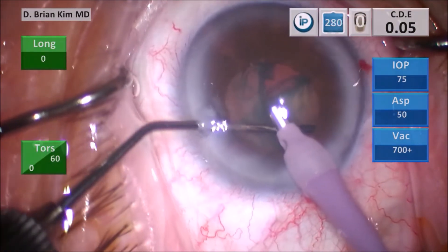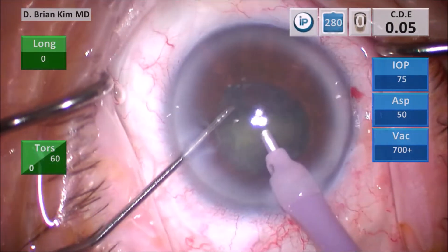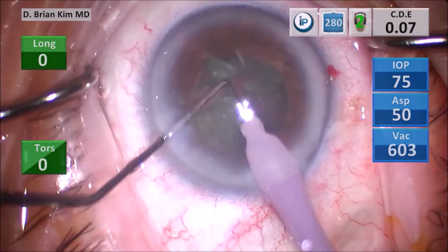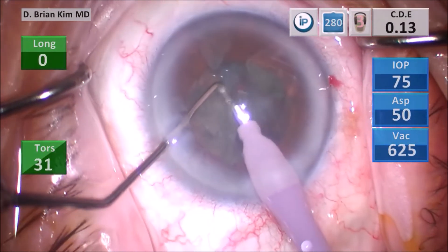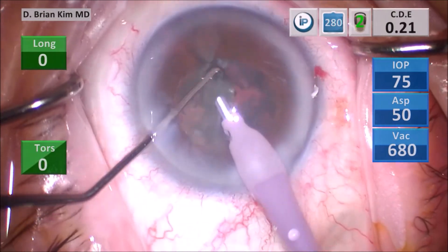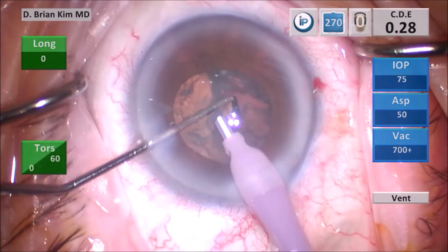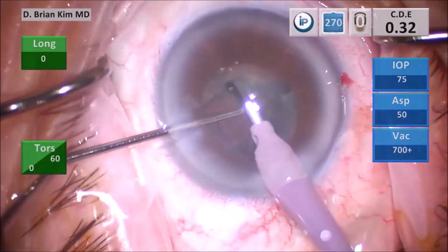I place the chopper out to the equator and prolapse the second hemi-nucleus, then begin crushing the lens pieces into smaller bite-sized pieces using mechanical fracturing forces. Once the pieces are small enough, I use high vacuum and a little ultrasonic energy to emulsify them. You can see all the action is in the central safe zone. I use the chopper to manipulate lens pieces out of the bag rather than grabbing them with the phaco — pulling lens pieces out of the bag with high vacuum and ultrasonic energy is, in my opinion, a less safe and less efficient approach.